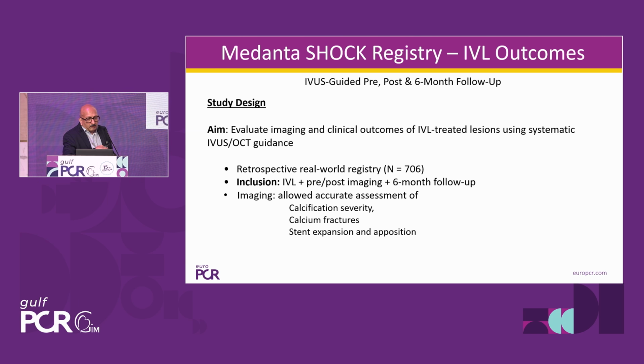Quickly now moving to our own registry, which is about 700 patients now. And here you can see that we did imaging for everyone. So that is our way to do it. So now I'm going more towards how do we do it. So imaging is almost always 100%. But let me tell you one thing, it may not happen every time because many times you are not able to even cross the device.